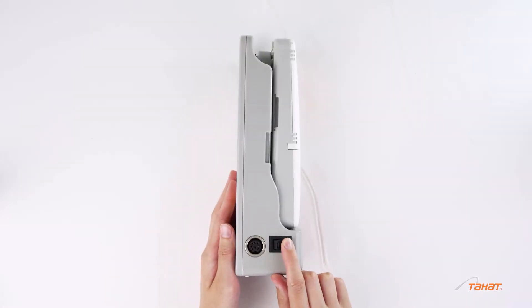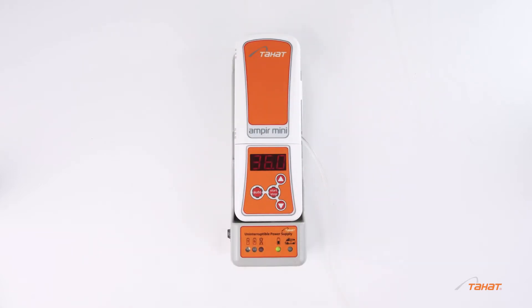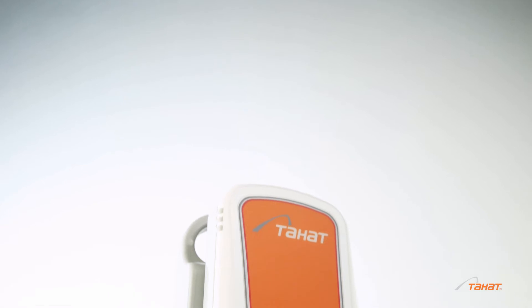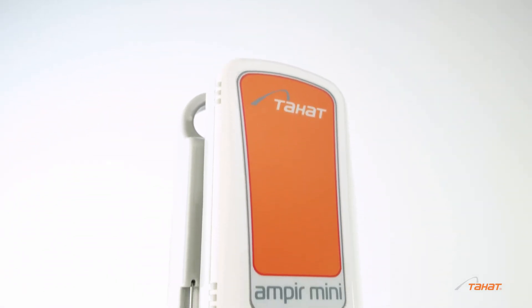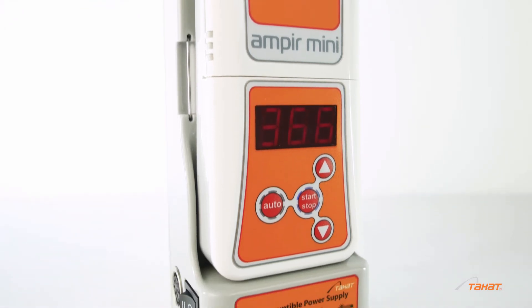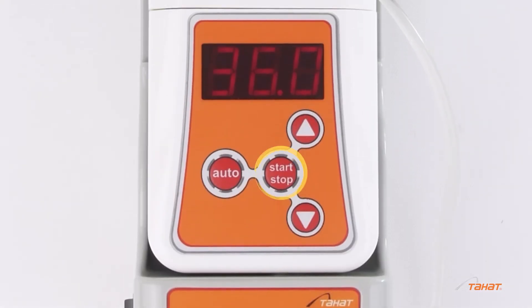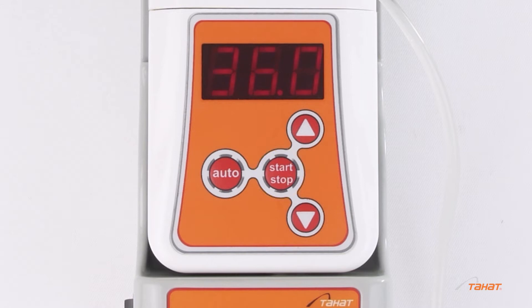Switch on the battery unit. The previously set temperature will appear on the display. Check the battery power level — a green indicator shows that the battery is fully charged. Start the operation and select the mode: manual or auto.